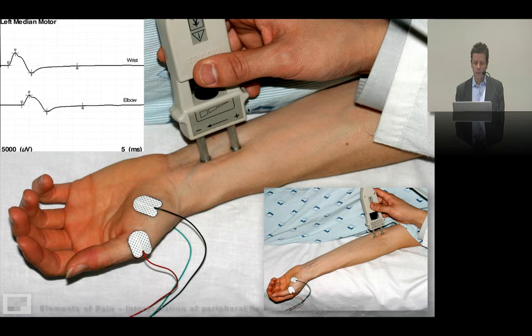So this is an example of what we do in doing a median nerve study at the wrist. So we provide an electrical stimulus. The current, by convention, will flow from the cathode, and so we supply this at the closest point over the median nerve at the wrist.